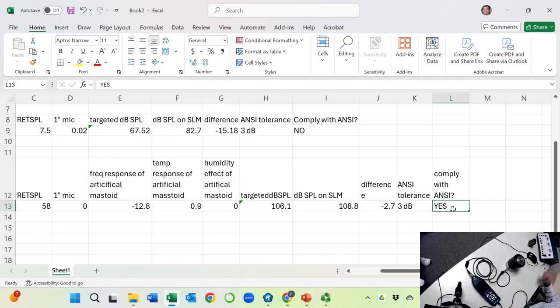I don't use this bone vibrator anyway. For my research, it's the same idea. Am I making sense? But if I want to calibrate, I know how to access the correction table. If Lindsay wanted to do a bone vibrator EP, then I would use this and make adjustments accordingly. But for me, I don't use it, and I think it's probably better to leave it like that for demonstration purposes. The insert is calibrated because I use it in the nursery. Okay, so good for this.